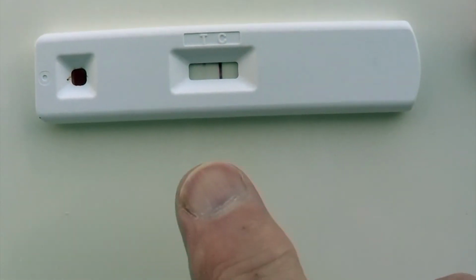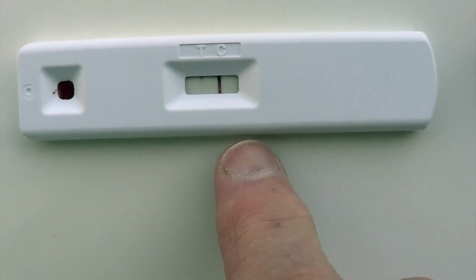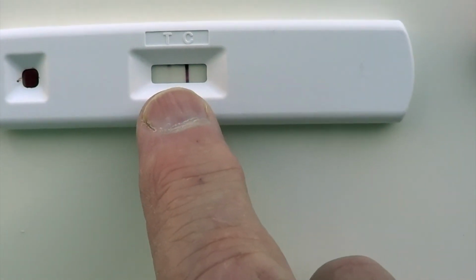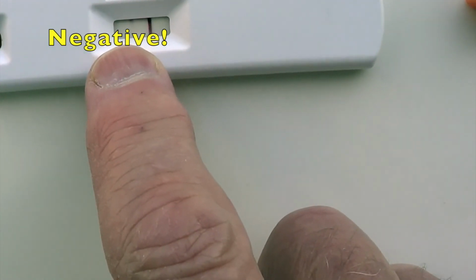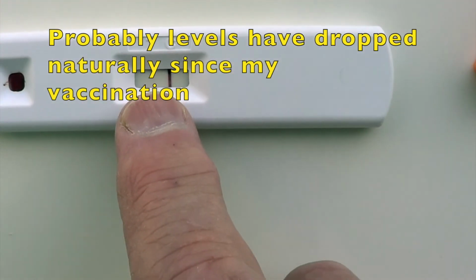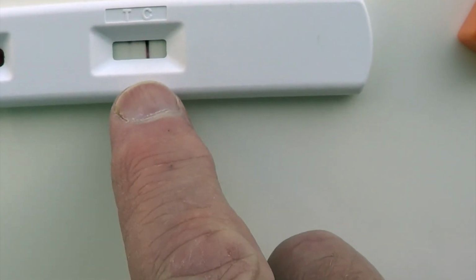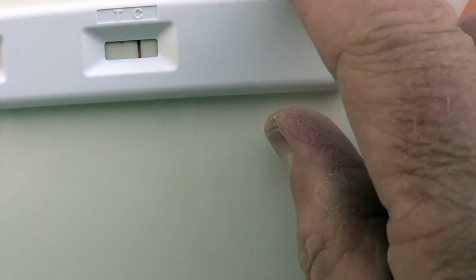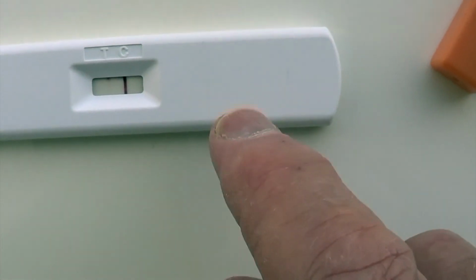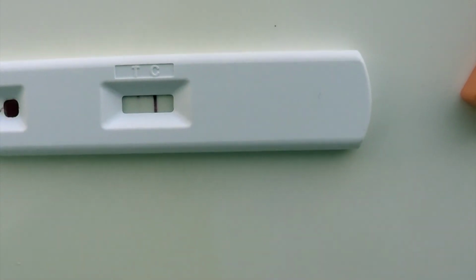Well, I think that test counts as a negative. It's been done correctly because the C line, the control line, is okay. The test line, I would count that as a negative. I can see a very, very faint line if your eyes are good. Very, very faint, but nothing like the illustration in the leaflet, so I'm going to count that as a negative, which means my antibody levels must have dropped. And it's something we shouldn't be concerned about, because that's a normal occurrence anyway.